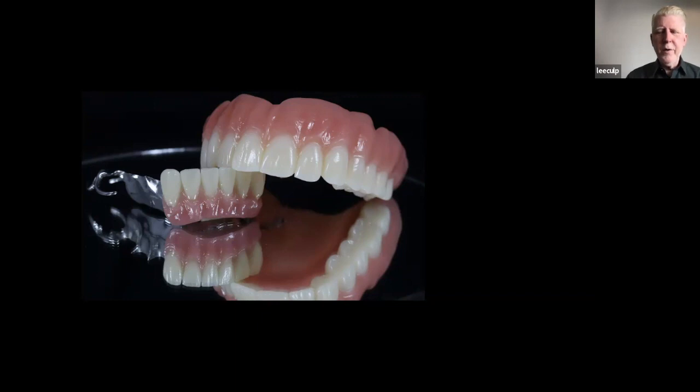So this is an upper denture that has been milled, base and teeth bridged together, bonded together. But then we designed a lower partial to go with this case because it was one patient. We designed the lower partial in the computer digitally, and then I sent it off to a place that prints RPD frameworks out of chrome cobalt, and they fit like crowns. I mean, literally, the fit on these things is immaculate.